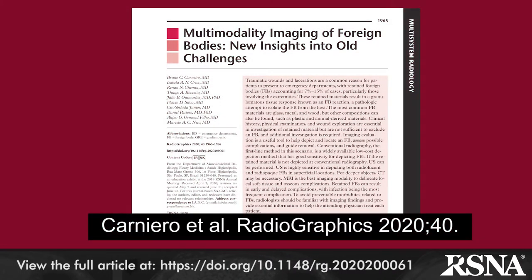In this article derived from a 2019 RSNA annual meeting education exhibit, Dr. Bruno Carneiro and colleagues from Fleury Medicina e Saúde Higienópolis in Sao Paulo, Brazil, offer a review of imaging of retained soft tissue foreign bodies.